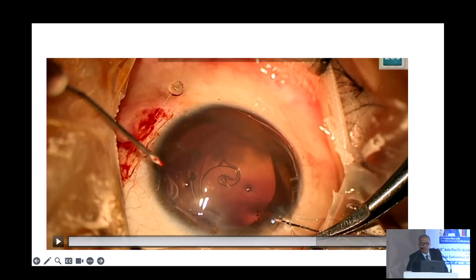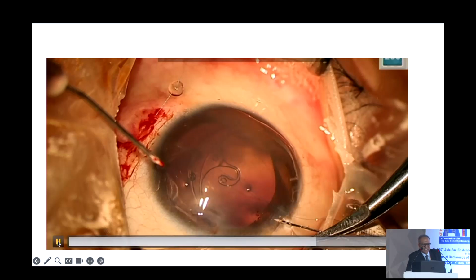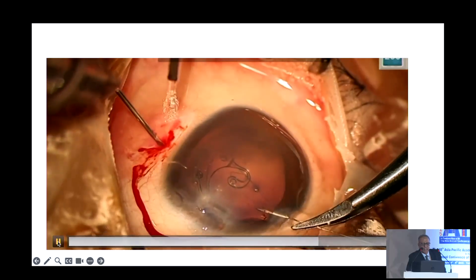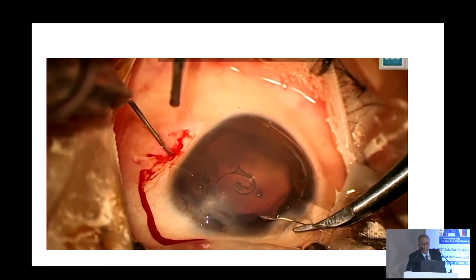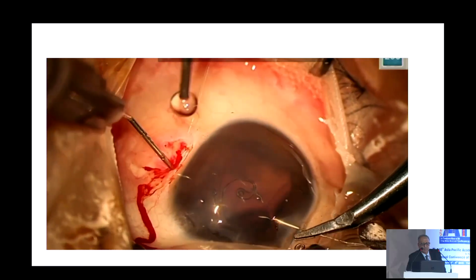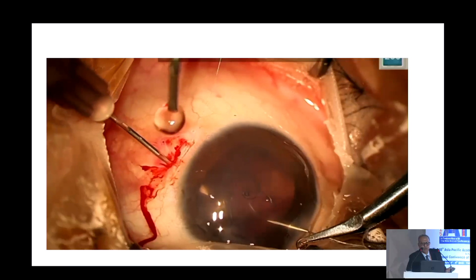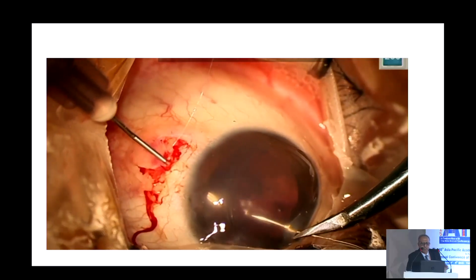Because at times, if you do a corneal entrapment, it creates a problem. Dr. Chi, you were about to lift the, okay. So I just do it and then I take it in, I railroad it in, go, then move it.